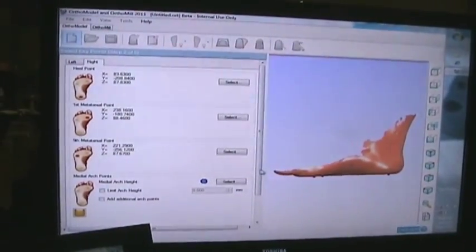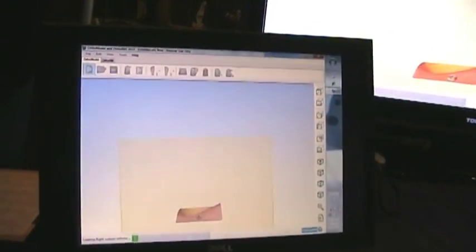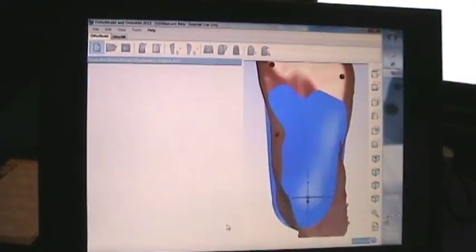Once we get the apex of the arch, all we have to do is press next, and the software is going to dissect the hind foot, dissect the mid foot, and also dissect the forefoot, and is going to design an orthotic based on the foot shape.